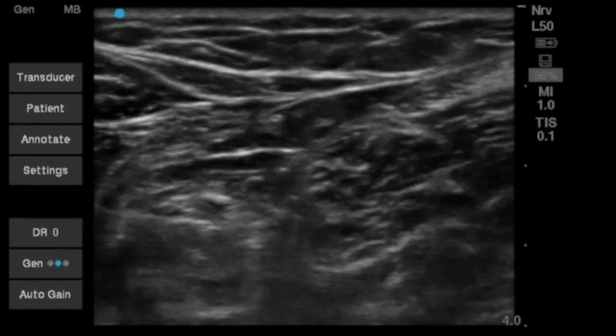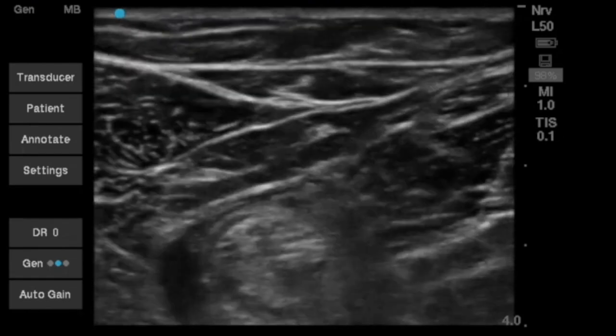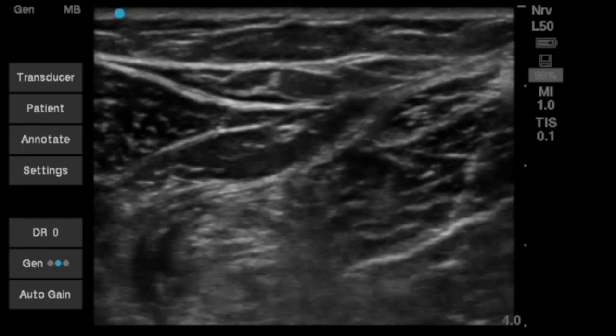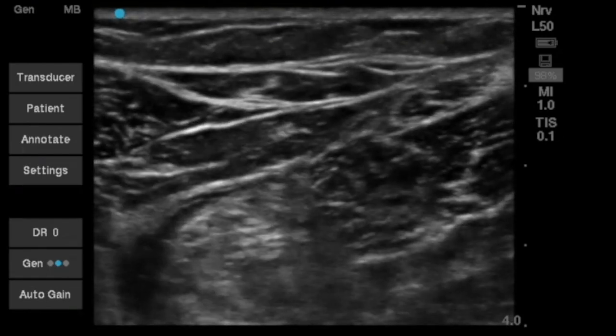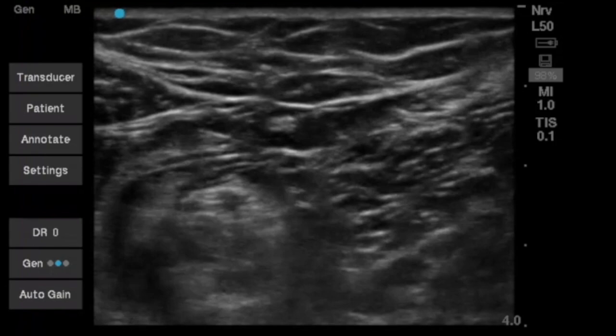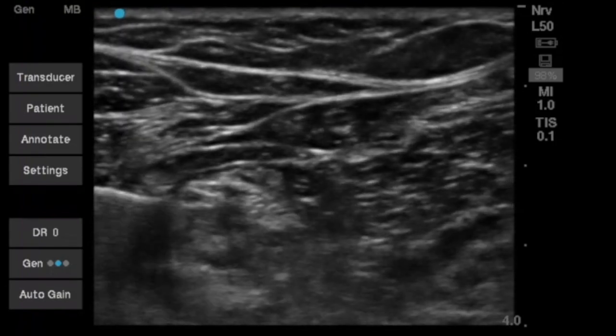Frequently, local anesthetic can be deposited between these two divisions to allow complete circumferential local anesthetic spread. We can scan up and down the leg to ensure local anesthetic spread cephalad and caudad along the trajectory of the sciatic nerve.